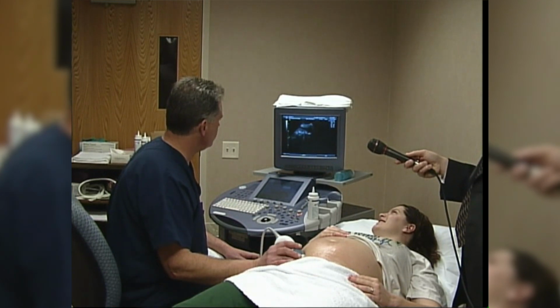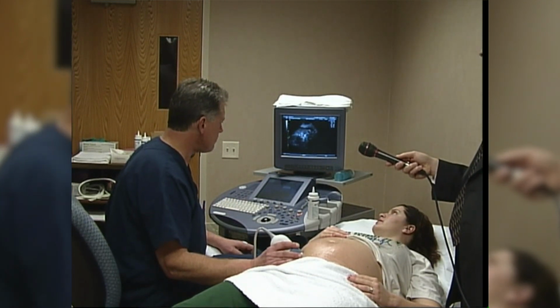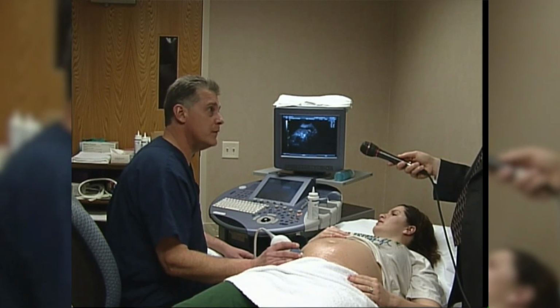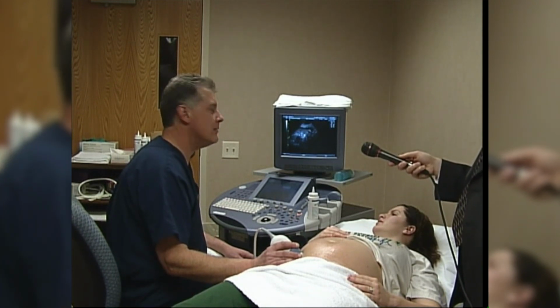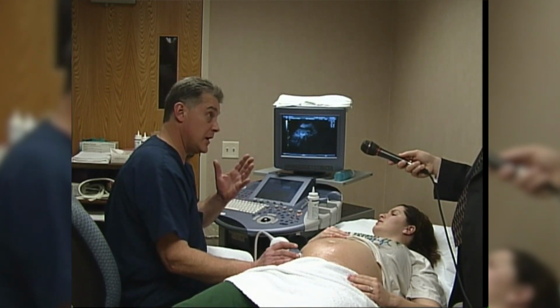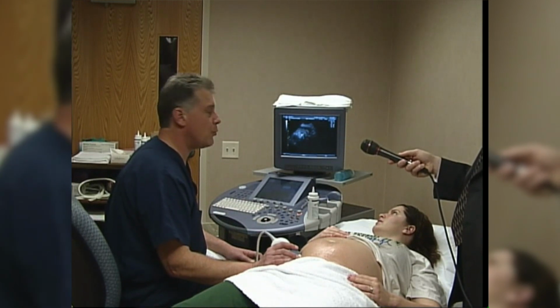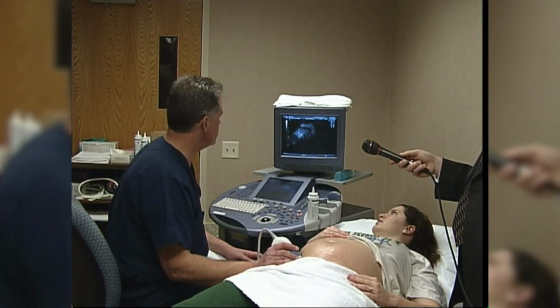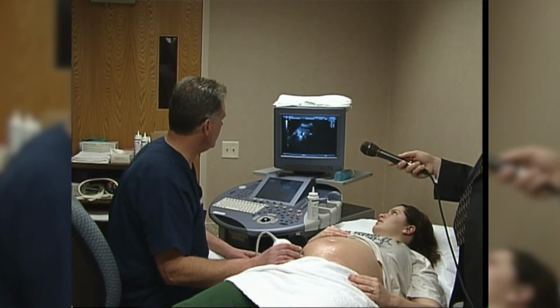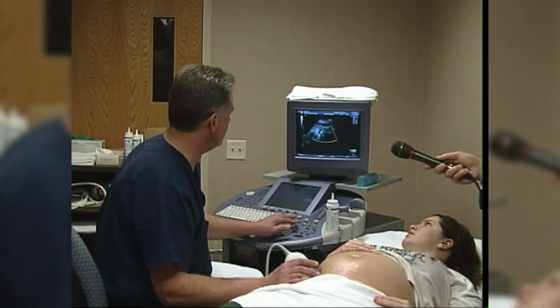As far as diagnostic uses for the 3D technique, it's very new. We feel like we're kind of pioneers in this area. In the radiology department, we can see nice surface rendering of the facial features, so cleft palate, cleft lip, those types of things. We'd feel pretty comfortable with diagnosing with that technique. It's going to help us really understand what that fetus is doing in there physiologically also.